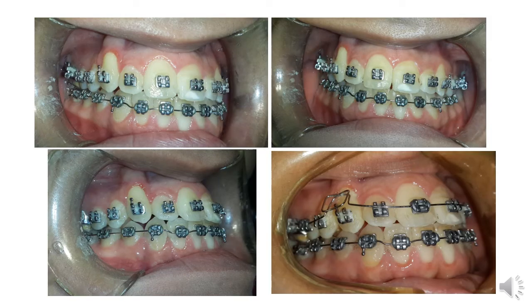Another example is the maxillary impacted canine that has been treated but again has some lingual crown torque because the impacted tooth has moved a long way down to the correct position in the dental arch. And the horizontal box loop is again engaged here to correct it.